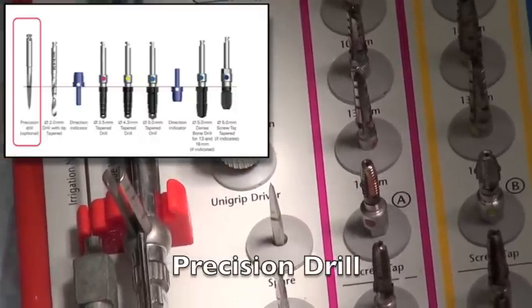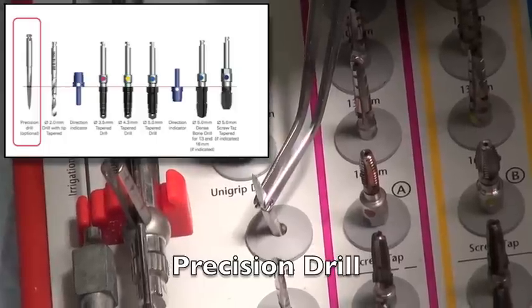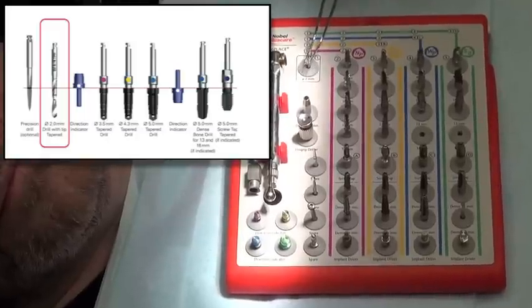We start off first by using a precision drill, which is not in the protocol really — it's an optional drill, but it's an important drill to get you where you want to be to start the osteotomy.